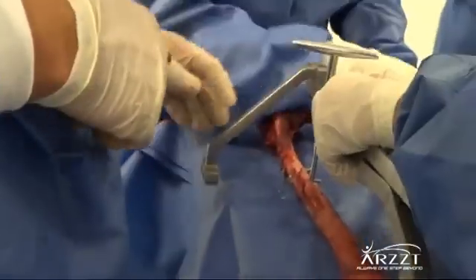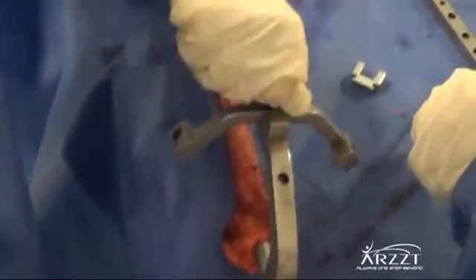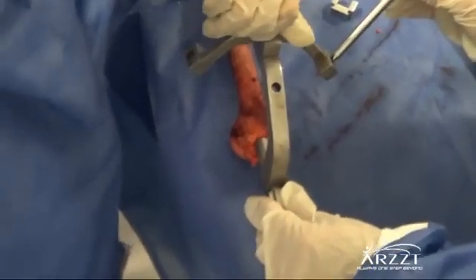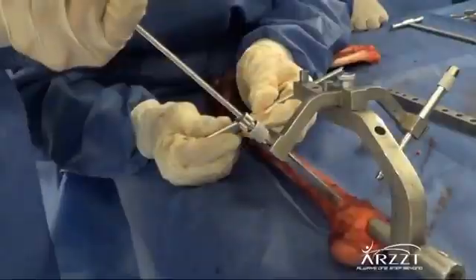The stabilizer is removed. The next step is the location and drilling of proximal holes with 3 different locations at 3 levels. The orthopedic surgeon will choose which are required, if 3 holes and 3 screws can be used due to fracture characteristics without hindrance.